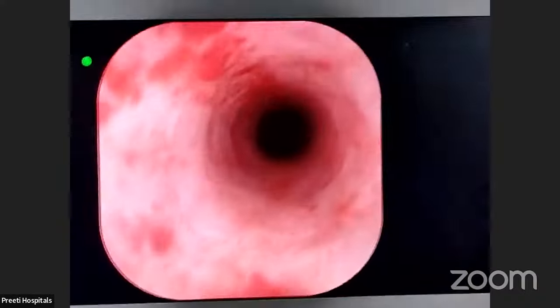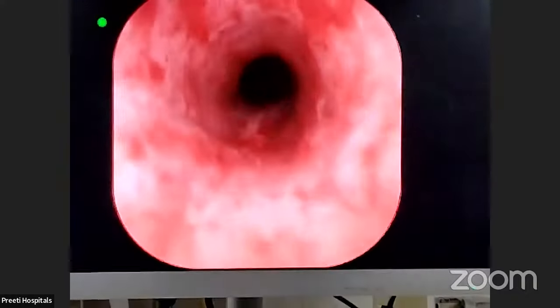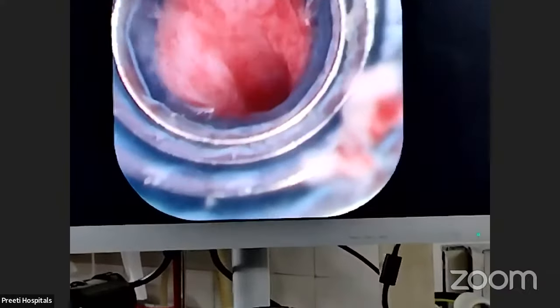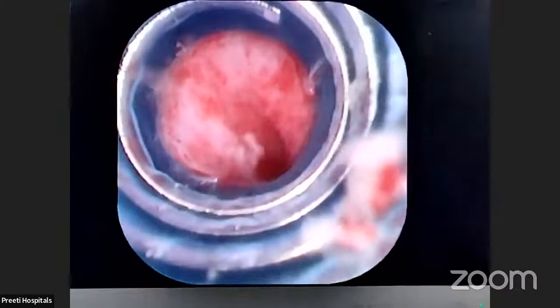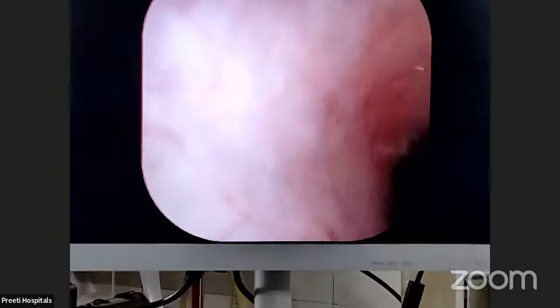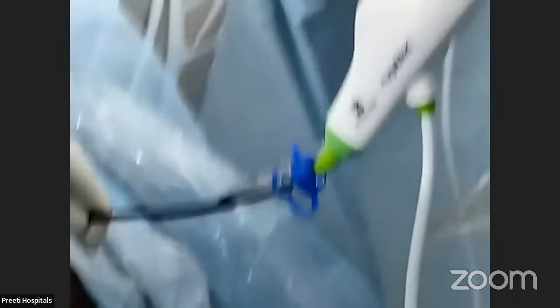So you come back and see where the access sheath is. If it is seen, okay. If it is not, see, it is stuck in here. So this is the problem with the hold. Now if you cannot pass it, we cannot show the RIRS because the sheath will not go here. This is exactly what the problem is now. So now what I try is, I will attempt with the flexible scope only.